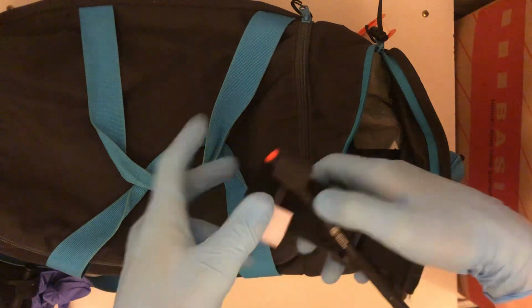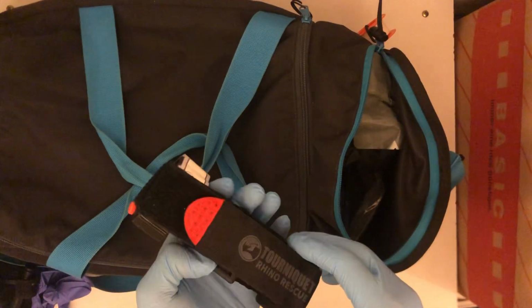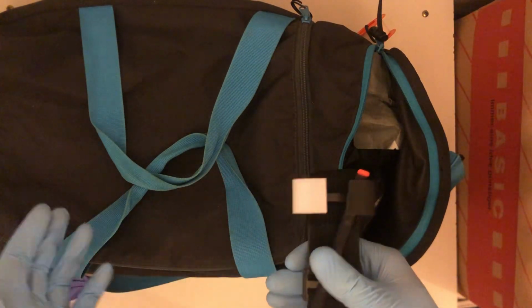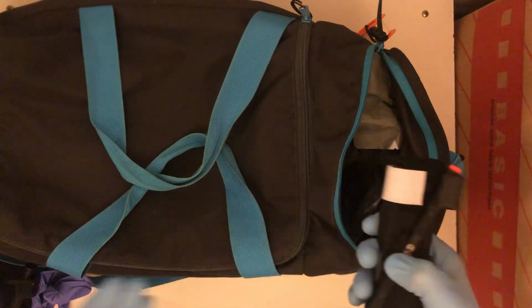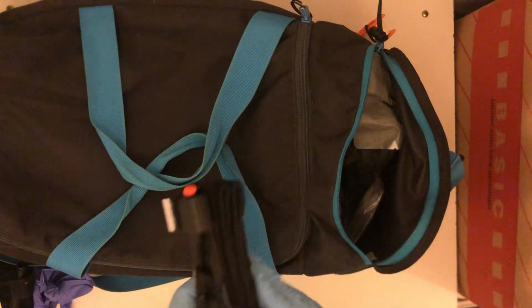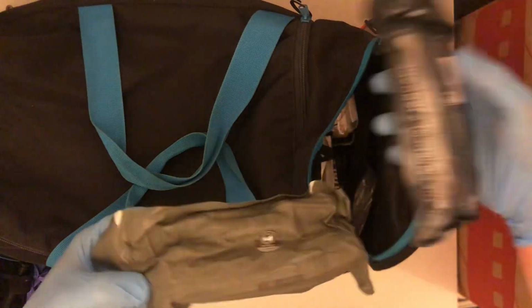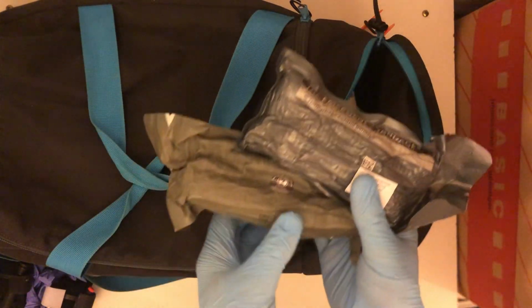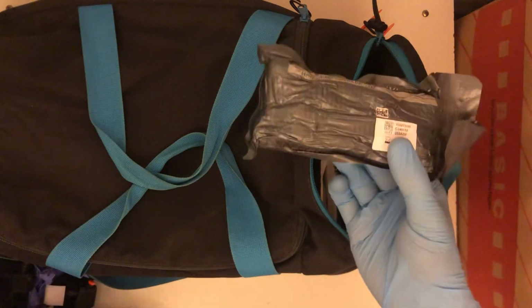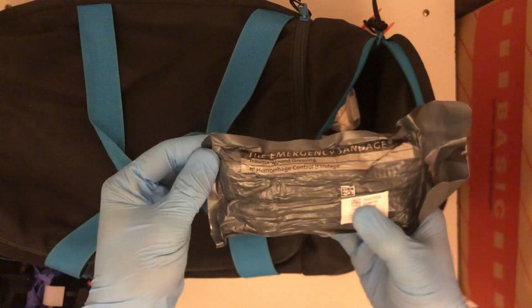This one is the Rhino Rescue one. I personally tested it and it works. I wouldn't recommend it to anyone in the combat field, but if you have other options for securing a wound, you can use Rhino Rescue tourniquets. Then I got two 6-inch Israeli dressings. One is from Rhino Rescue, and the other one is from Persis Medical. Those are the real ones from Israel.